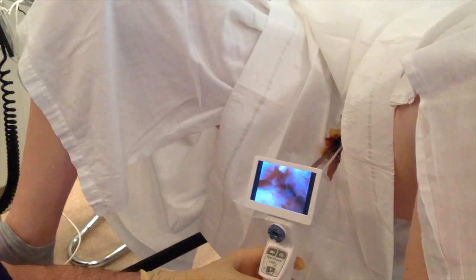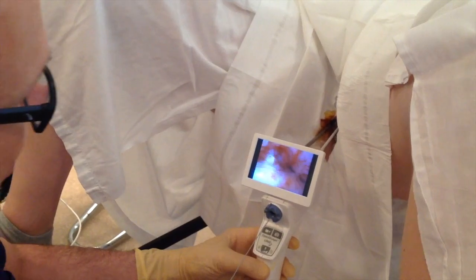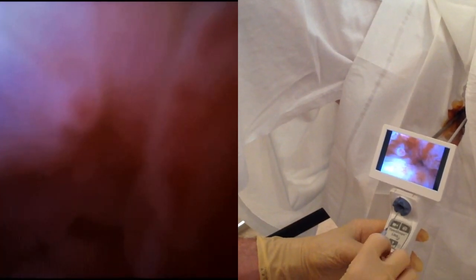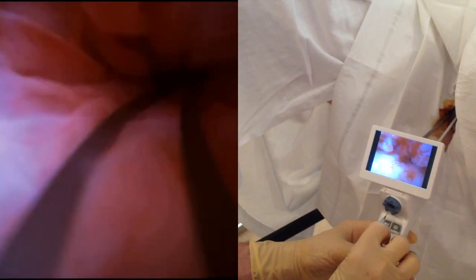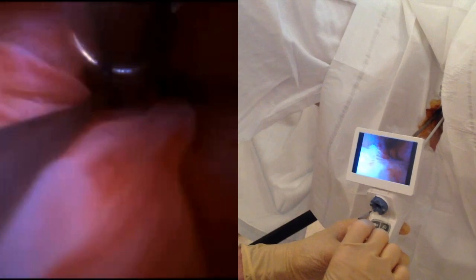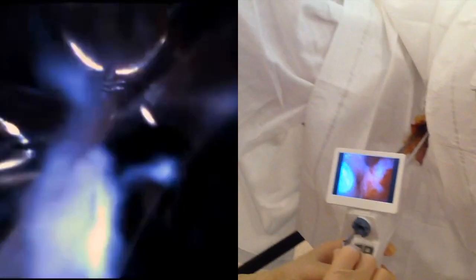I'll take a little grasper from the scope and slide it right down — just like this — and it goes right in. The patient is tolerating the procedure really well. We grab the strings, we can see it, and pull it all the way out. And there we have ourselves an IUD.